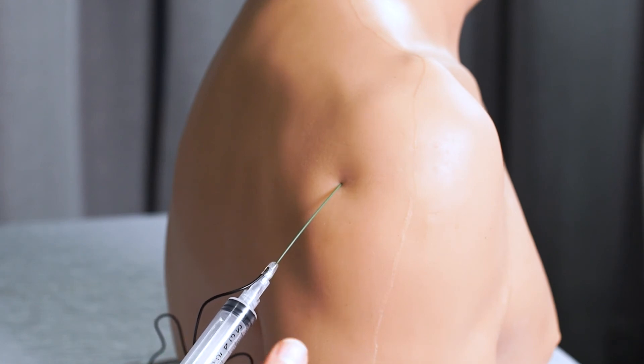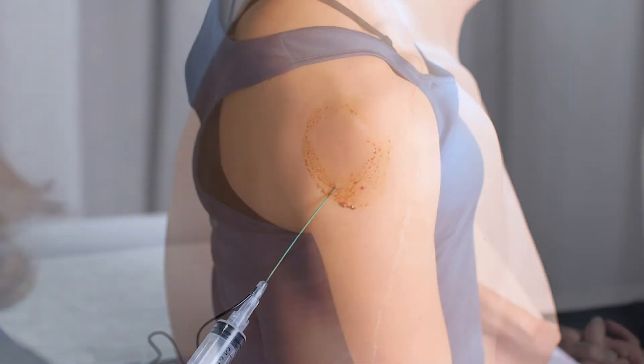That's probably about where it would be for the patient — about an inch and a half deep. Once you're there, you would aspirate and then inject the fluid all together, and then you would back out.